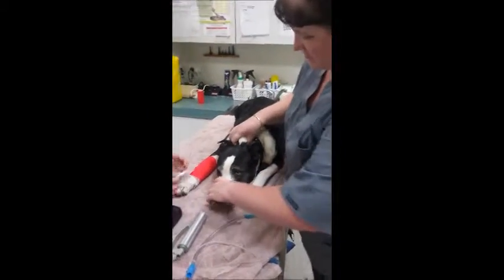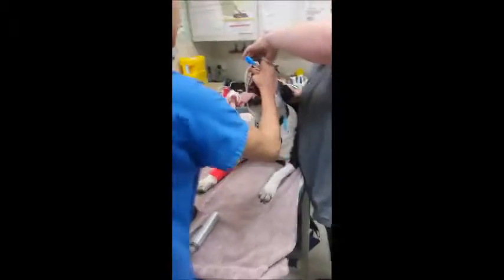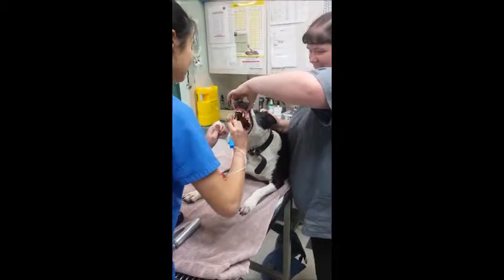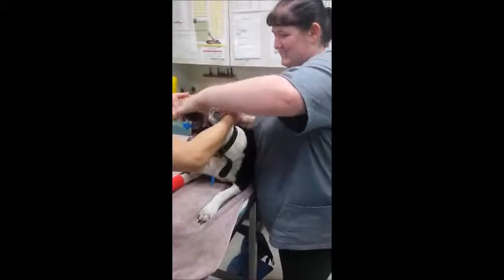The patient is still in sternal recumbency for intubation. I hold the upper jaw and the scruff at the back of the neck so the veterinarian can pull the tongue out and lower the bottom jaw. This is done so the epiglottis is clearly seen.